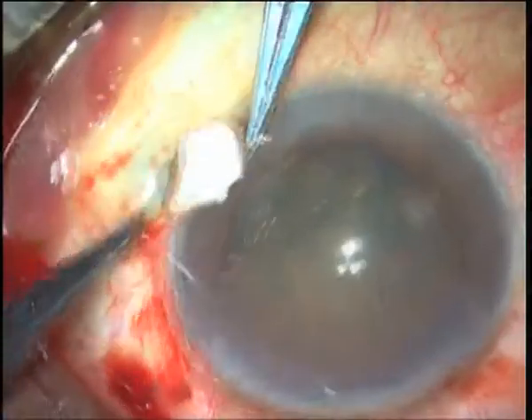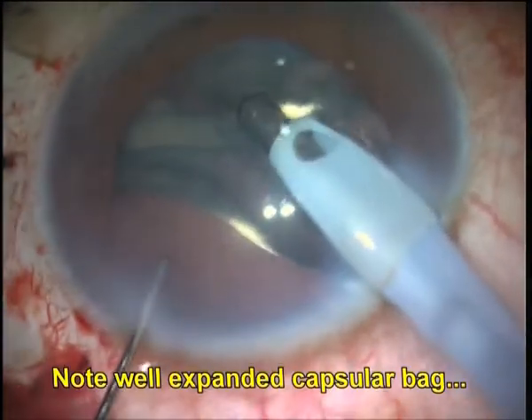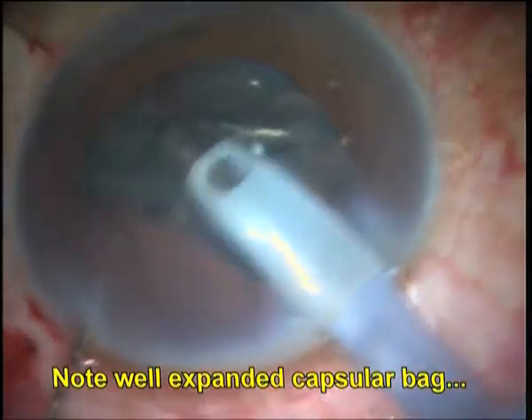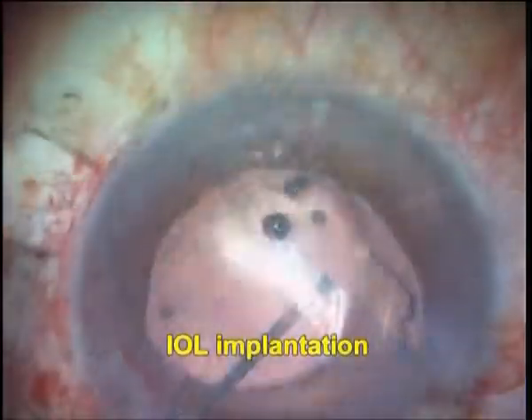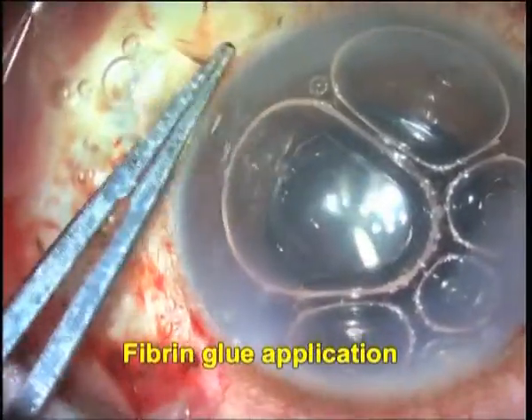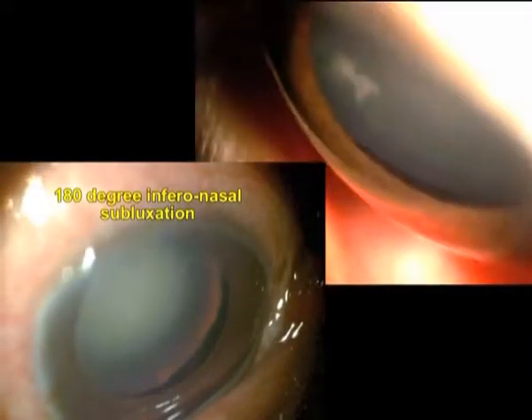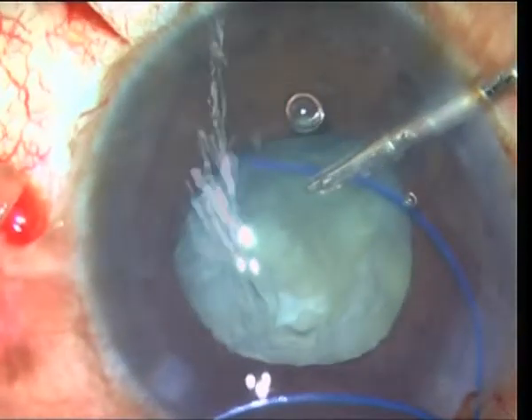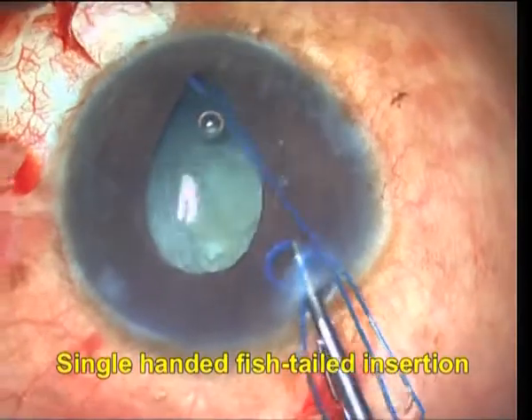The centration of the capsular bag is easily and rapidly adjustable at any stage by simply adjusting the tuck of the haptic, unlike in sutured capsular fixation where once the suture is tied down, readjusting centration of the capsular bag is more complicated and takes considerable extra time and effort by the surgeon.